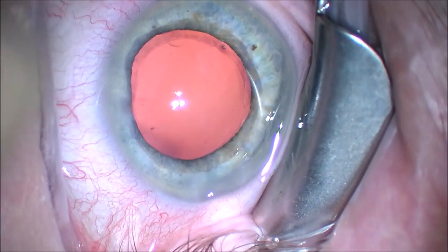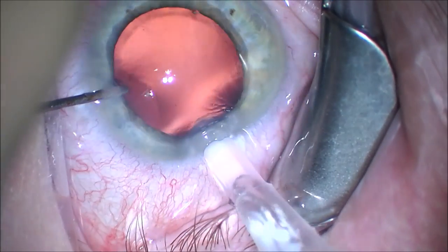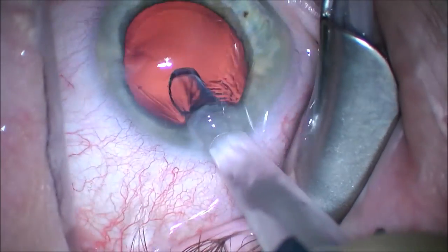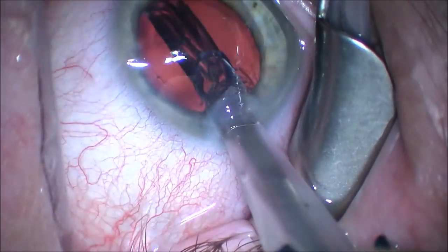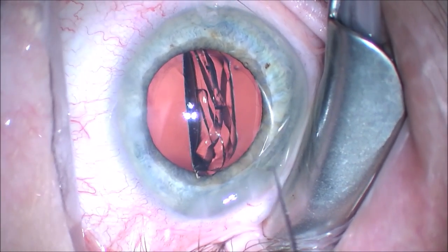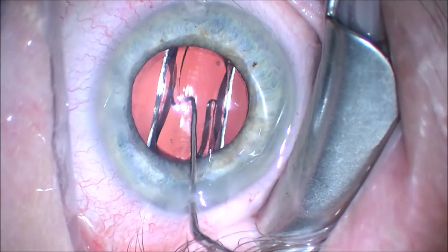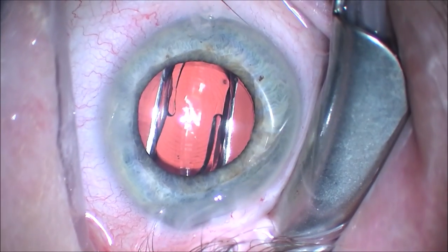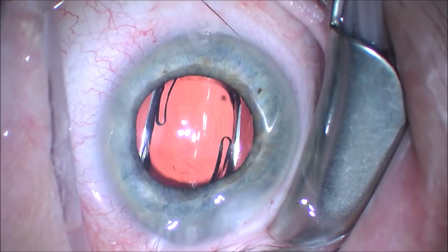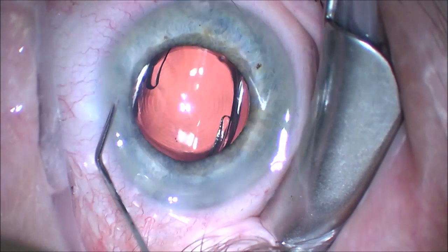We fill up the anterior chamber and the capsular bag with a cohesive viscoelastic, and we inject the new AMO Symphony lens into the capsular bag using an injector and cartridge. You can see that the intraocular lens delivers straight into the capsular bag. We make sure that the trailing optic and haptic are under the anterior capsule. If they are above the anterior capsule, this will cause a pigment dispersion syndrome with the haptic or optic rubbing against the peripheral iris.